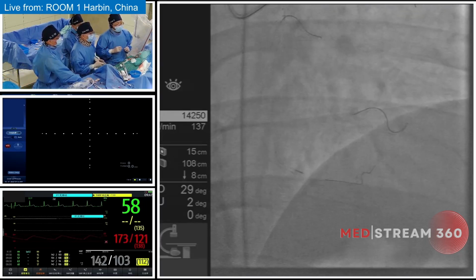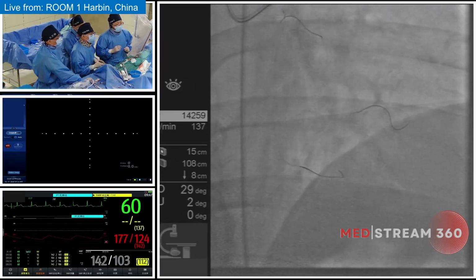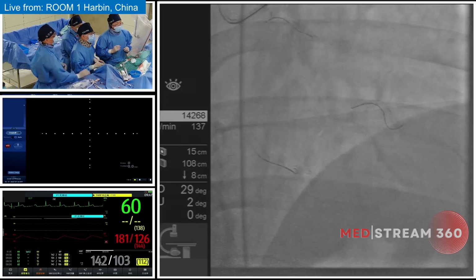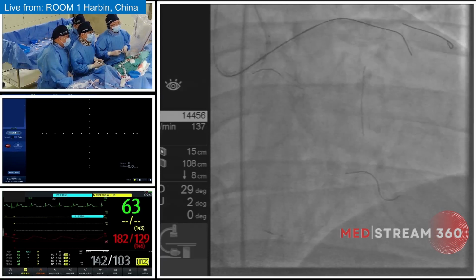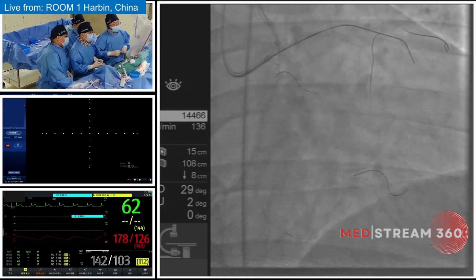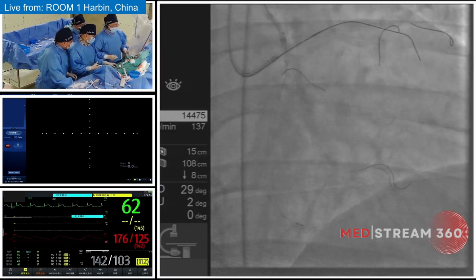I don't think that this branch could be used. Really, not very good. Okay, should be this one. It's hard to say where its exit point is. Yeah, maybe in the proximal portion. Okay, maybe some double channel, but closer to.